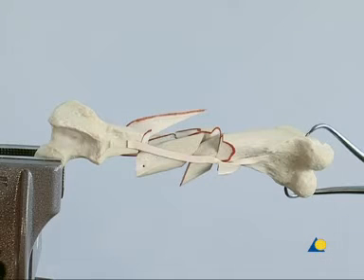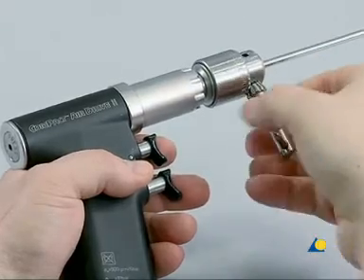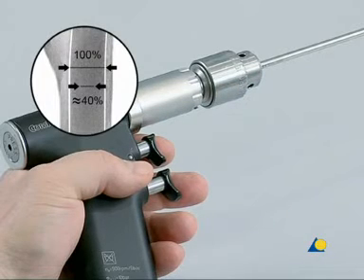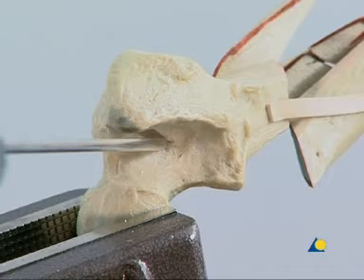The femoral head is secured in the vice with the lateral surface towards the surgeon. The pointed reduction forceps is applied to the distal end of the femur in order to control the movements of the distal segment. A 4.5 mm intramedullary pin is inserted into the chuck and secured with the key. In a clinical case, when an intramedullary pin is used in combination with the plate, the diameter of the pin should be approximately 40% of the diameter of the medullary cavity in the region of the femoral isthmus. The intramedullary pin is inserted in a normograde fashion, with the landmark being the greater trochanter. The tip of the pin is positioned on the proximal part of the trochanter and slid medially into the trochanteric fossa — this is the point of entry.